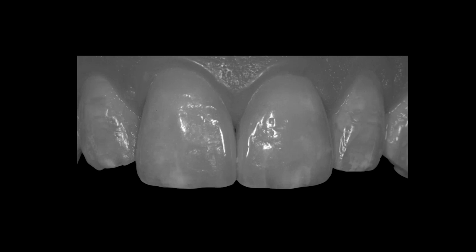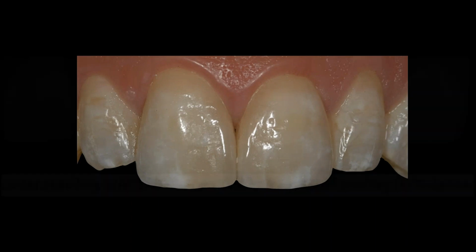Ask me what it takes me to build the crown today. If I use 6 powders or 90 powders, I'm going to tell you it's 18 to 26 minutes per tooth. But where I need to spend more time is under a scope, looking at these little surface details to really make that work. And that's where I think that fine art process comes in, right? Especially when we're not really working with color, because in this case, I wasn't. I was really just making a window veneer, which is almost translucent at that point.